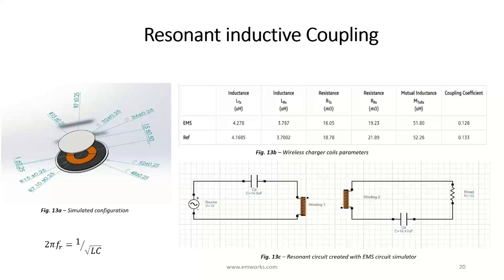This goal can be achieved by having primary and secondary coils operating at the same resonant frequency. Two series resonant capacitors should be added to both the transmitter and the receiver circuits. The capacitance value of each capacitor is calculated using the resonance formula. This formula contains the resonant frequency and the inductance of each coil. This is why the inductances of the coils must be accurately calculated.